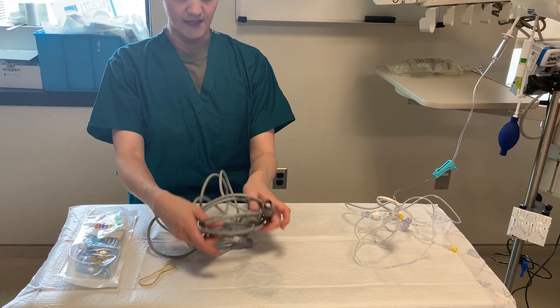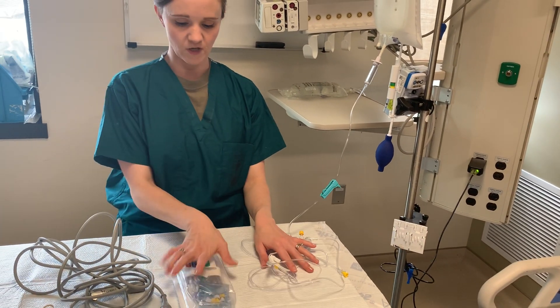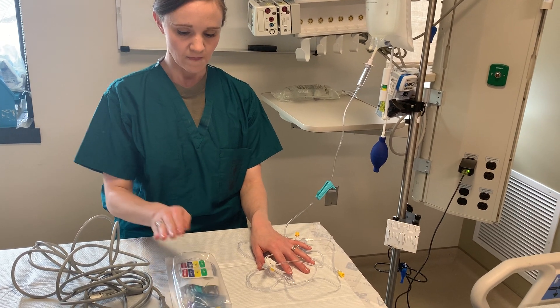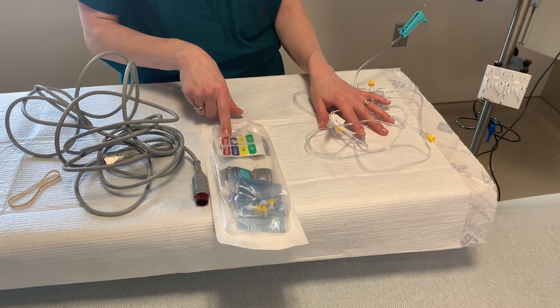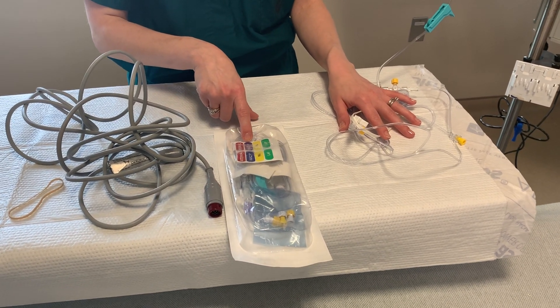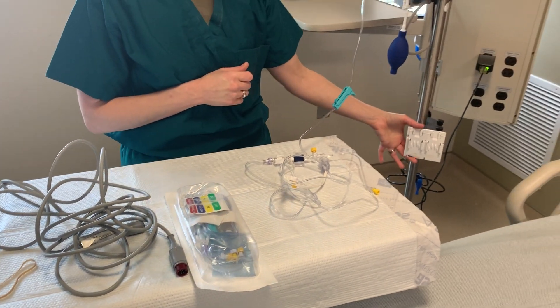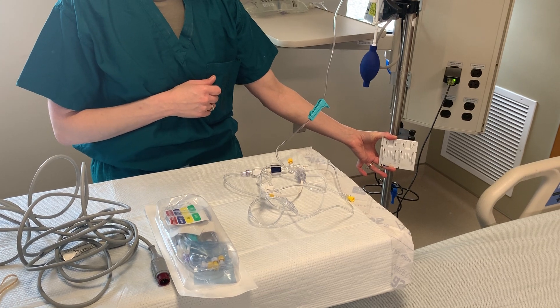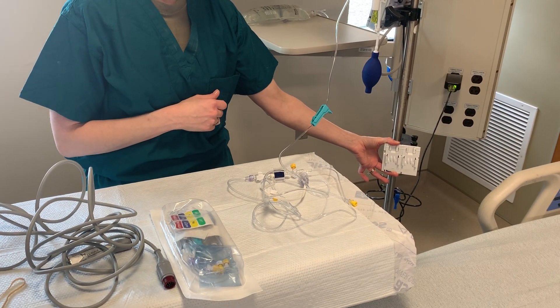I've already got this tubing out of the package here for you. I wanted to show you what it looks like inside the package. It comes with labels so you can label whether you're transducing an arterial waveform or a CVP waveform on your holder, which is one of the other required items. The holder will place the transducer near the patient's heart, which is where you will level the transducer.